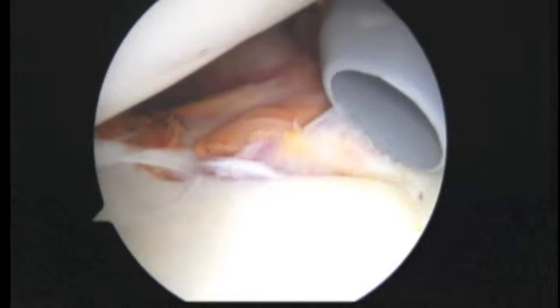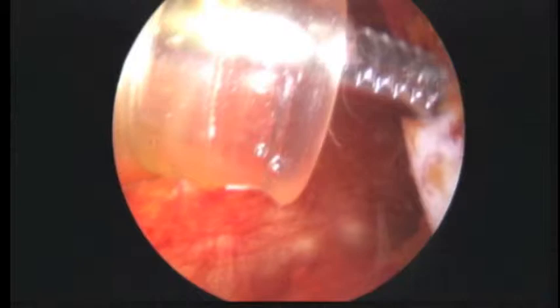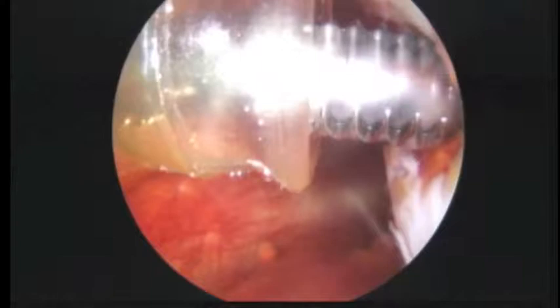As we look from the front to the back now, we can again see this area in the humeral head that we call the Hill-Sachs lesion right about here. I don't see anything else loose as far as cartilage. I'm just cleaning this off to make sure there's not some loose flap or something else that we want to know about, and also to assess the depth.